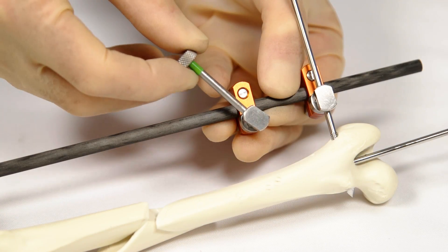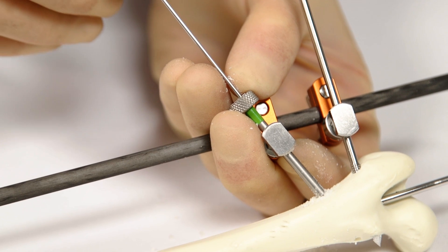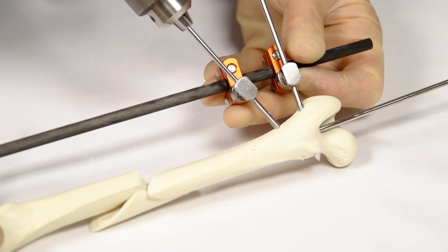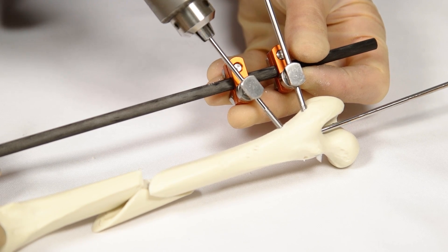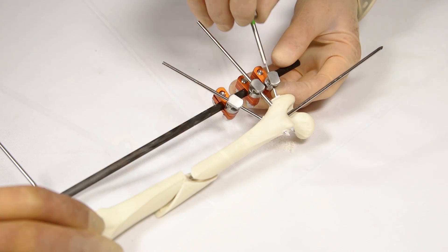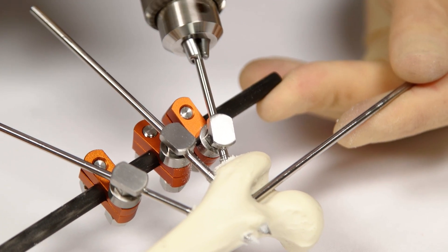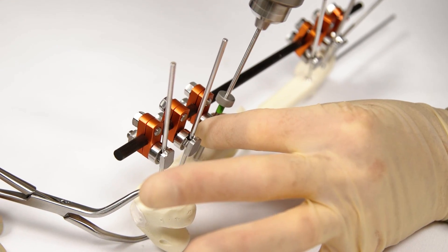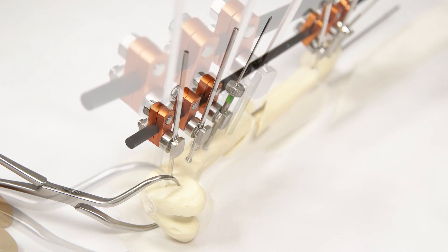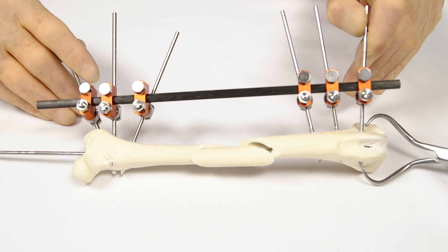Further pins are now placed to complete the linear ESF. These pins must be pre-drilled and placed through clamps that have been pre-loaded onto the connecting bar, to ensure that positioning and trajectory of the pin hole in the bone match the clamp position and orientation. In accordance with the rules of external fixation, two to four pins per bone segment should be placed, but only in safe corridors that avoid blood vessels, nerves, and muscles. Pins cannot be placed in the mid 60 to 80% of the femur due to overlying muscles, so remaining pins must be placed in the relatively small proximal and distal segments. Depending on the configuration of the comminuted fracture, it may only be possible to place two to three pins in each bone segment.